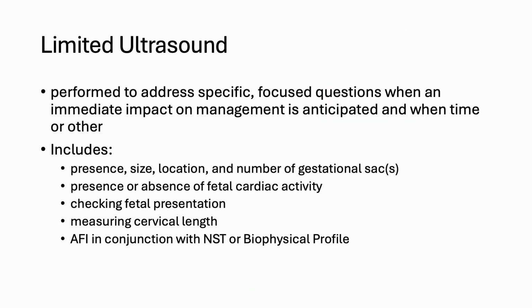what's being done. So a limited ultrasound, which I talked about in another of the presentations, is performed to address a specific focused question when an immediate impact on management is anticipated. This is what we as certified nurse midwives can become certified in if you wanted to pursue that.